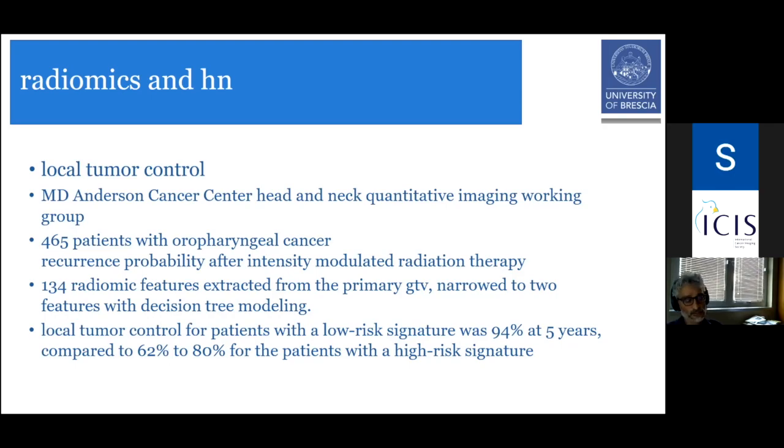So this seems to offer the grounds for more easily reproducible studies, because in this network, everyone is using the same machine, the same sequences, which are locked by the producer, and the same protocols. So this really diminishes all the variabilities that I discussed in the first part of the presentation.